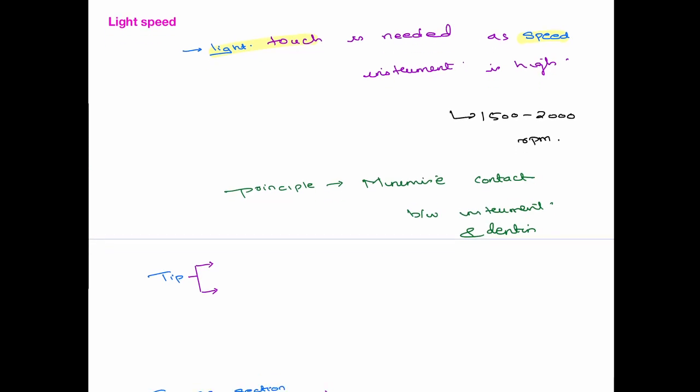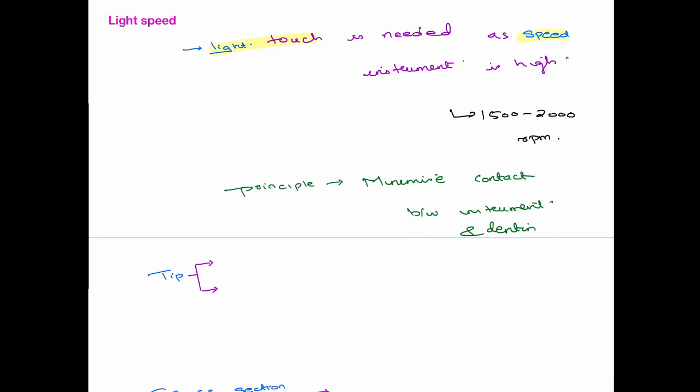Basically, you know that the cutting efficiency is much lower here. Now, the tip of this file is non-cutting. And remember, I'm not specifically mentioning it in other cases, but all are non-cutting tips. The tip is different from the cutting edge. If you take a file, this is the tip, and here you'll have the cutting edge.